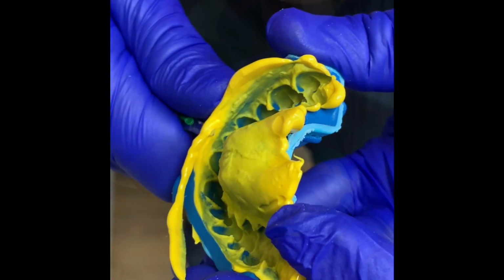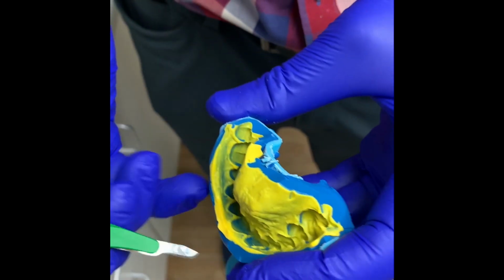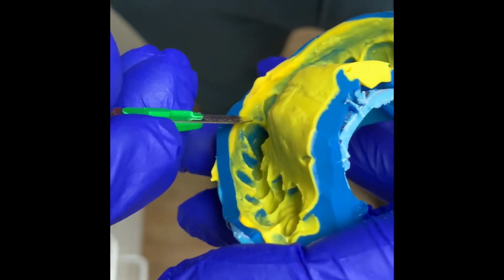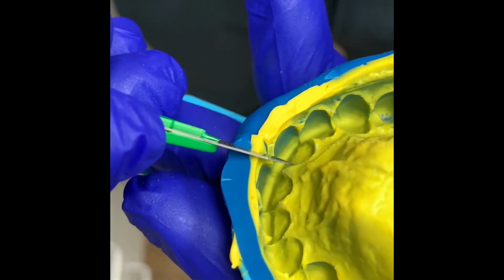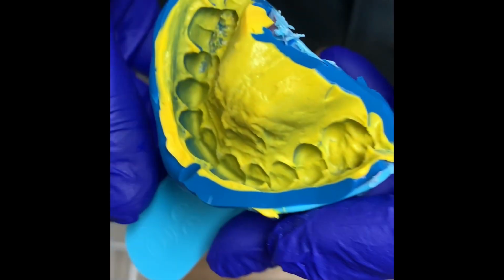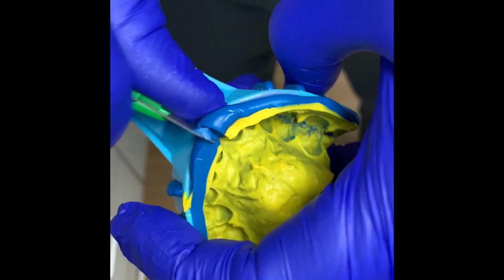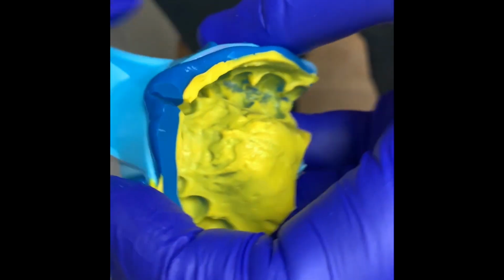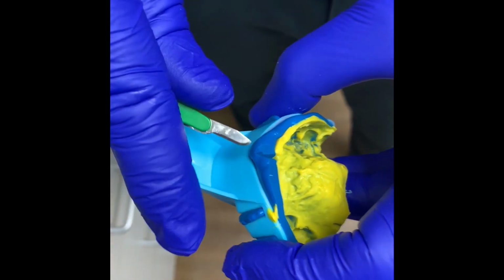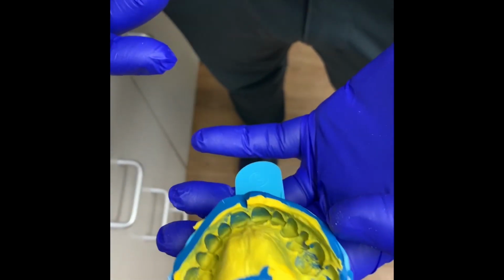Then the final step after I've trimmed everything is, right in between teeth 8 and 9 on these long span temporaries, I like to cut a little V-shaped notch. That gives me proper orientation in the mouth. When I seat this tray, I'll even widen that a little bit, so that it coincides with the midline of your full arch putty matrix. At this point in time, you're ready to go.